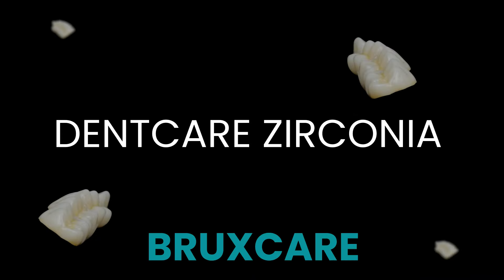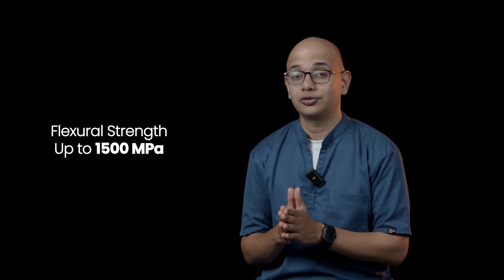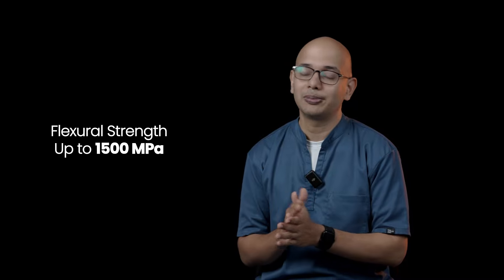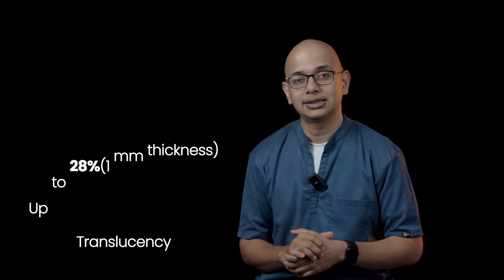Denkai Zirconia Bruxcare is a high strength zirconia, perfect for patients suffering from bruxism. It is a 3Y high alumina zirconia with an in vitro flexural strength of around 1500 MPa and a translucency of around 28% in 1 mm thickness.